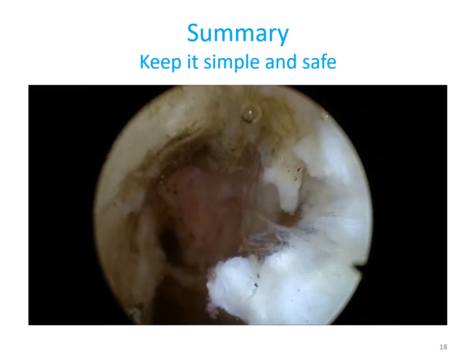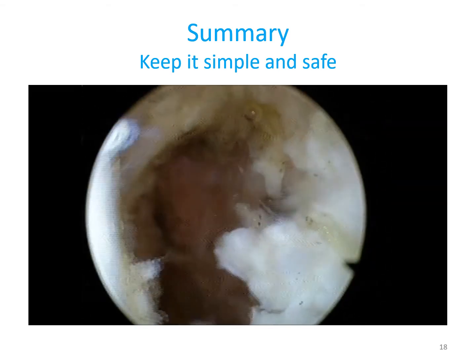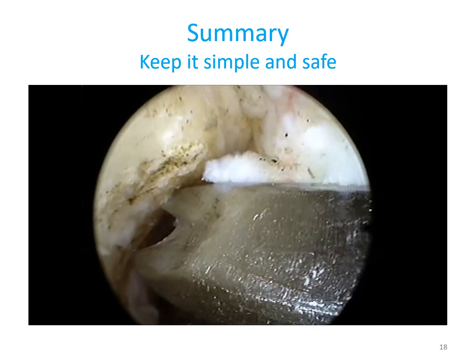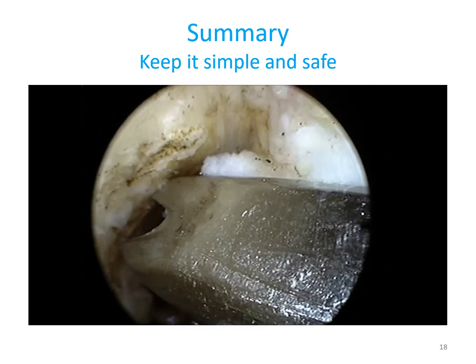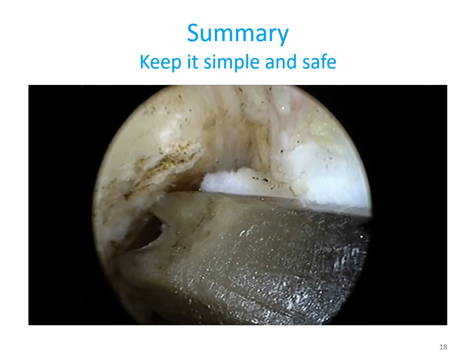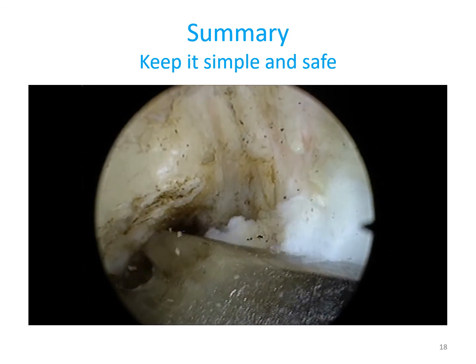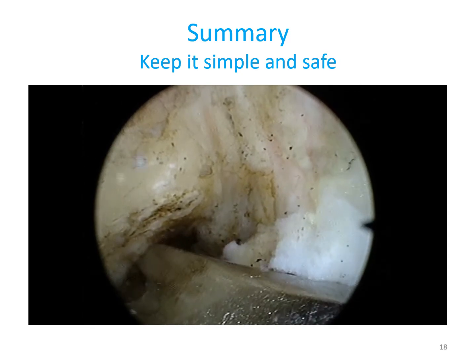So in summary, keep it simple and safe. This is again a right knee. Just feel the lateral intercondylar ridge. This is the arch that we see. This is the lateral intercondylar ridge. Please be posterior to it in your drilling. No part of the fiber should be anterior to it.